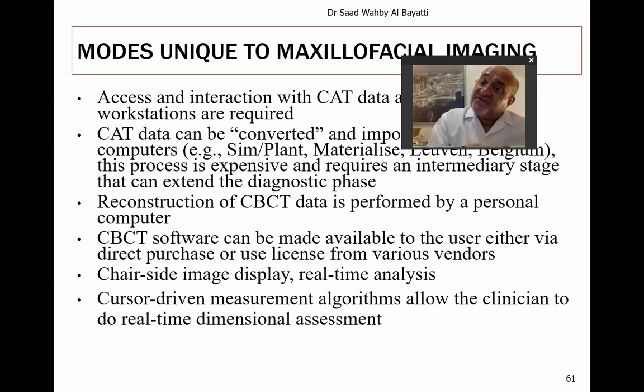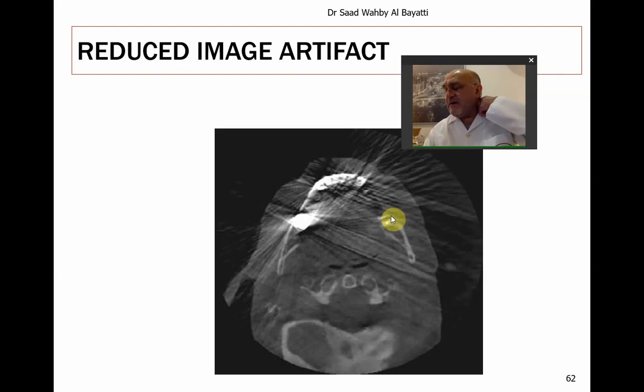and then you can print it on a 3D printer. The surgeons now are making use of pre-constructions, like wires on a 3D skull or a 3D mandible, so that they can formulate whatever they want to use on a skull, like in cases of resection of tumors and these things. So you can pre-design your treatment on a printed skull, and then you can convey it directly on the patient during the operation.